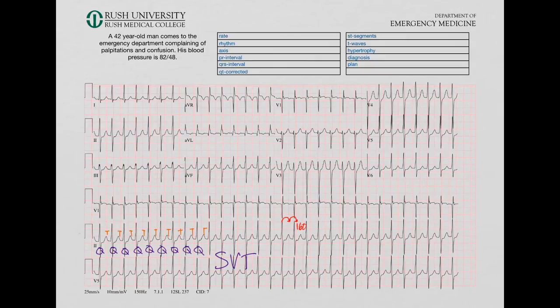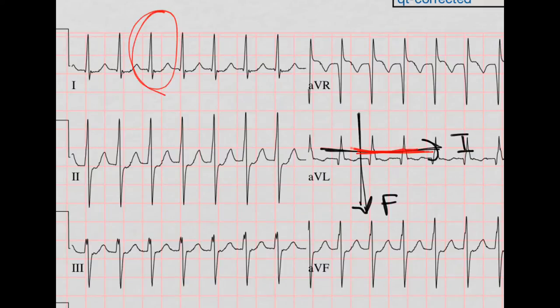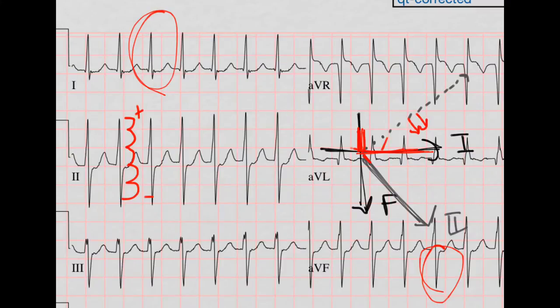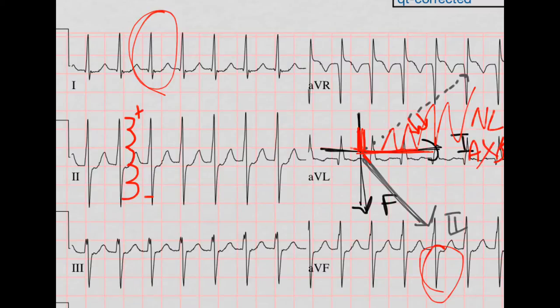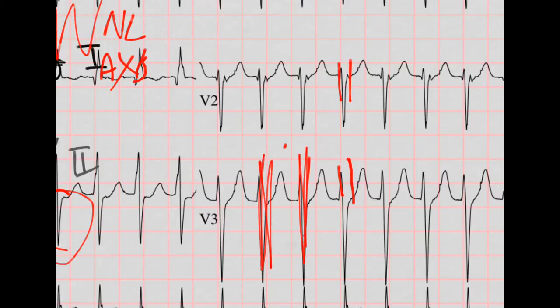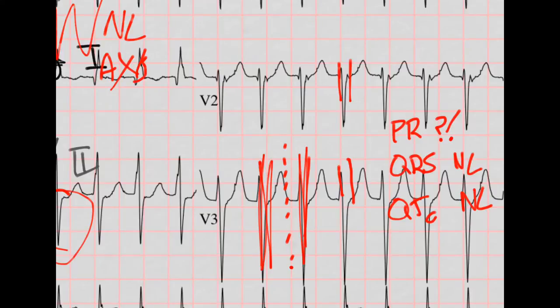Now let's look at the axis. Lead 1 is mostly positive. F looks like it's mostly negative. So now we need to look at lead 2 — about two and a half boxes positive and two boxes negative, so it's a little bit more positive than negative. We're on this side of the line, which means we have a normal axis. For intervals, there is no P again so we can't do a PR. The QRS is pretty narrow — about two to two and a half small boxes, so that's good. For the QTc, using the bisection method, it's pretty close to the middle but on the good side, so the QTc is also normal.